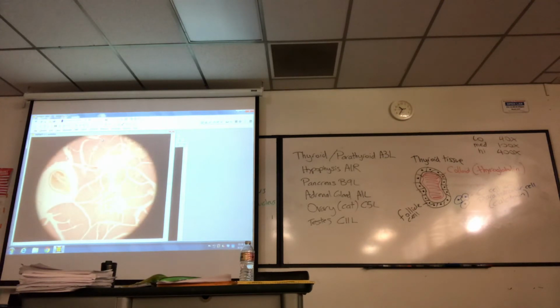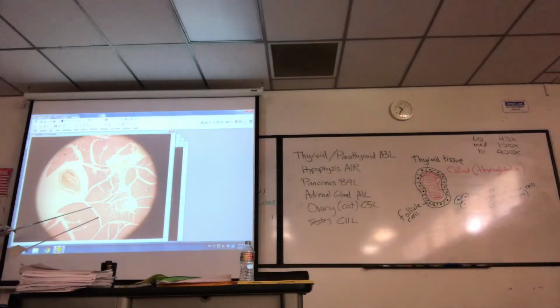A lot of blood vessels in the pancreas. See that? Boom, boom, boom. Those are probably blood vessels. We're not concerned with that. All of this is exocrine tissue, but we're looking for little patches, little clumps of cells that stain a little bit differently from all this dark tissue. That's our endocrine function. I think I see something here. I'm going to zoom in.